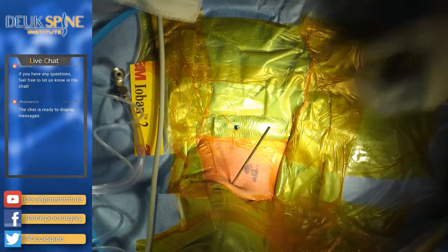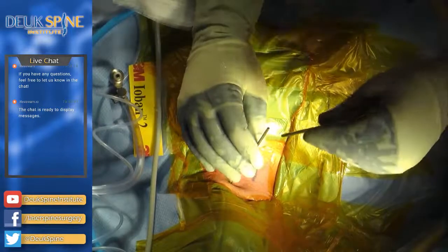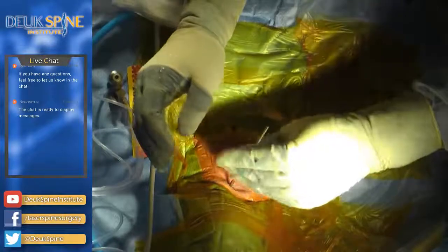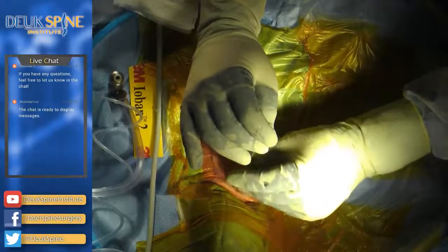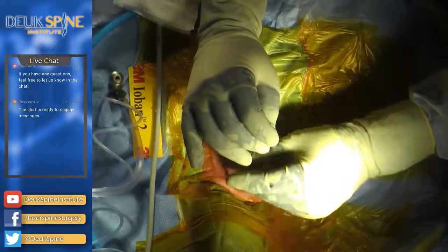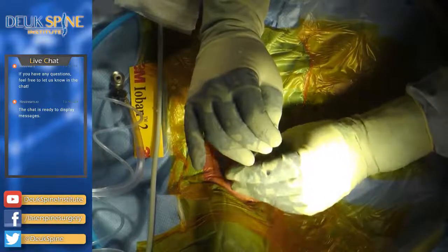Mallet, I'm going to bring this forward a slight amount more. I really want it embedded right where I want it in that herniation. And here we go. We're bringing the tube down. And we're going to slide this tubular retractor over the dilator, through the soft tissues of the neck, past all the vital organs, to the front of the spine. And then I'm going to pass it through the disc from the front to the back without damaging the disc.